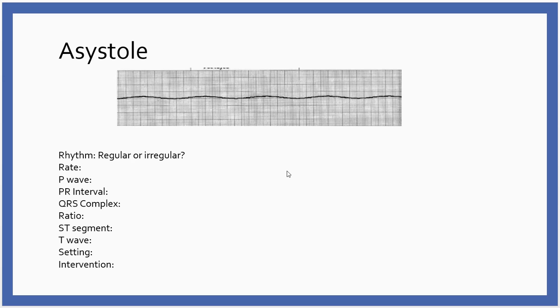But the thing with asystole is because we really don't have any electrical activity going on here, we can't defibrillate. Defibrillation is trying to reorganize electrical activity, and we have none. Really all we've got is good airway breathing, chest compressions, and remember from ACLS, we especially want to think about H's and T's. We want to figure out what the cause is and try to fix that. So that's what we're going to go at. Good CPR, good airway breathing, figure out what the cause is, and hopefully we can get that patient back.